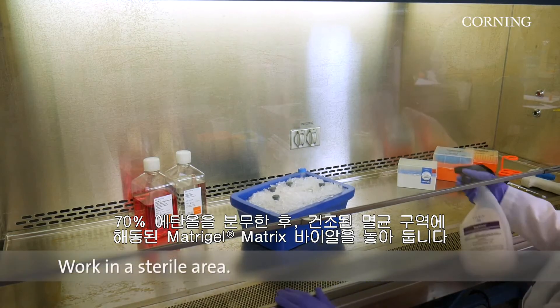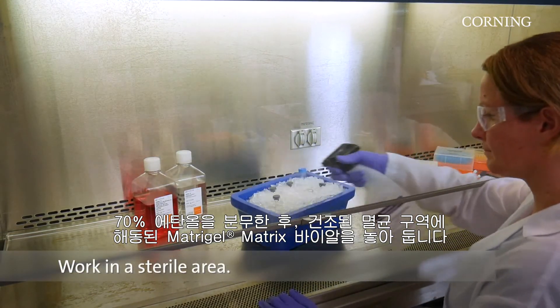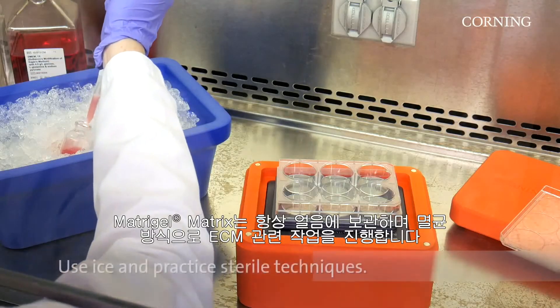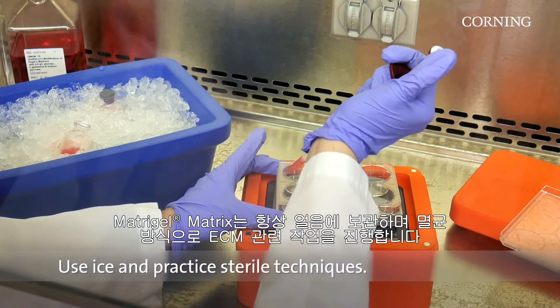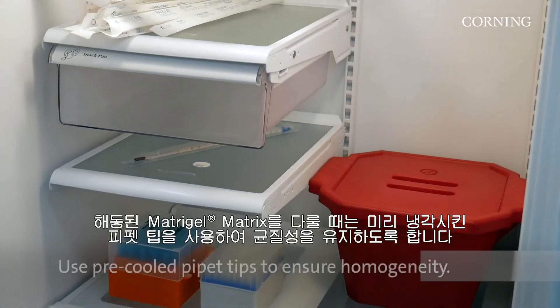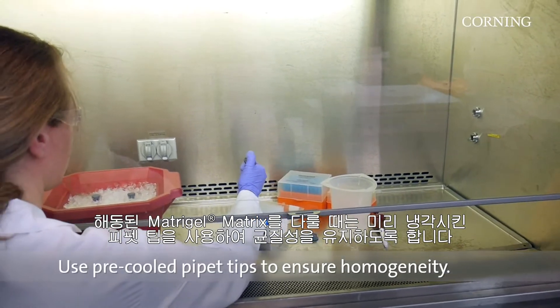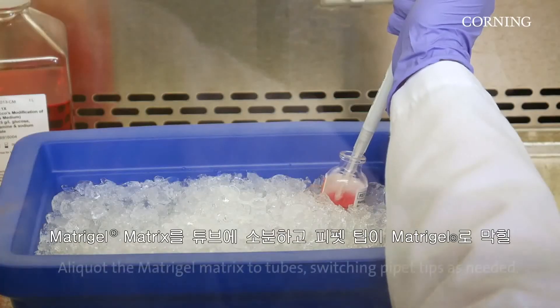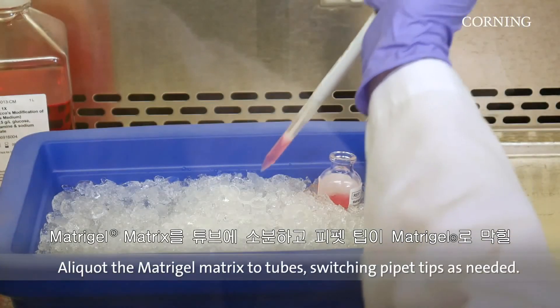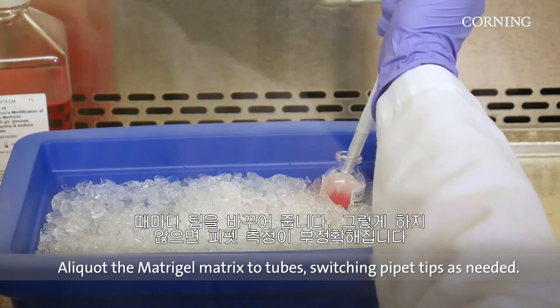Place thawed Matrigel Matrix vials in a sterile area that has been sprayed with 70% ethanol and air dried. Keep Matrigel Matrix on ice at all times and practice sterile techniques while working with the ECM. When working with thawed Matrigel Matrix, use pre-cooled pipette tips to ensure homogeneity. Aliquot the Matrigel Matrix to tubes, switching tips whenever Matrigel is clogging the tip or causing the pipette to measure inaccurately.